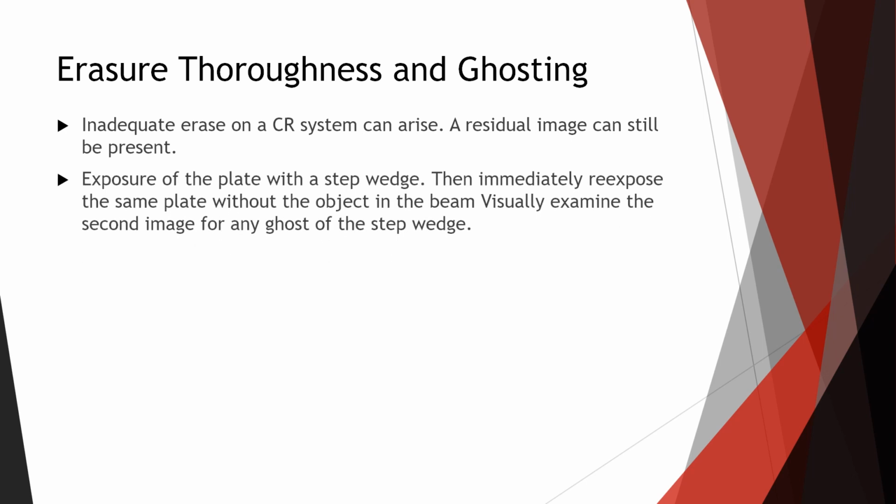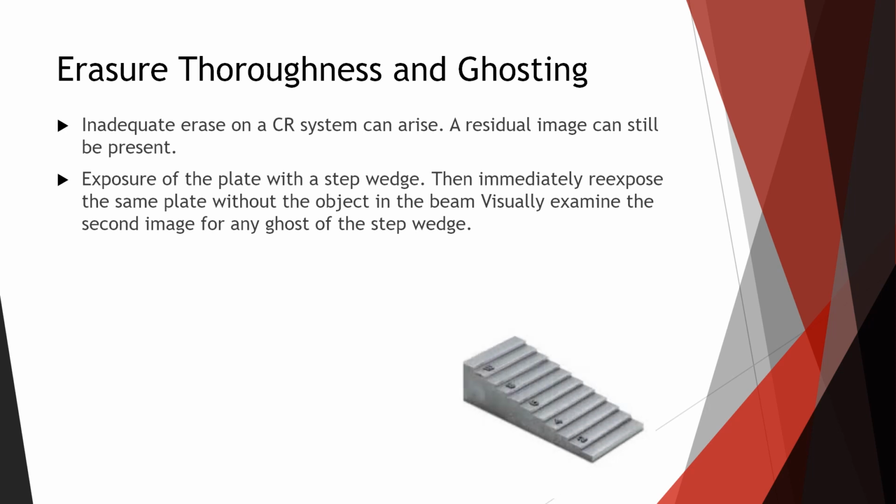Expose the plate with a step wedge, then immediately re-expose the same plate without the object in the beam. Visually examine the second image for any ghosting of the step wedge. So we take an exposure with a step wedge, which can be seen right here.